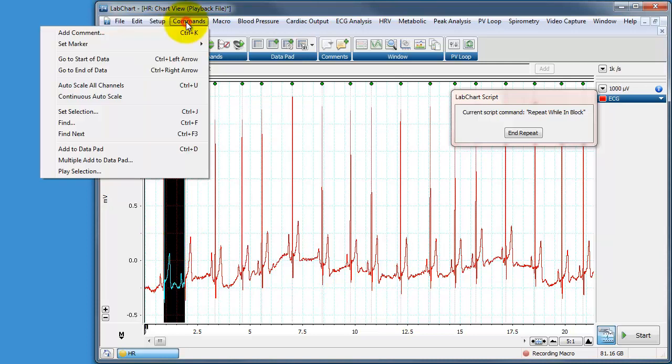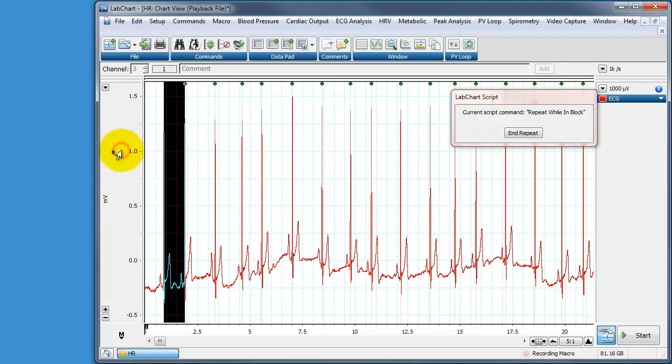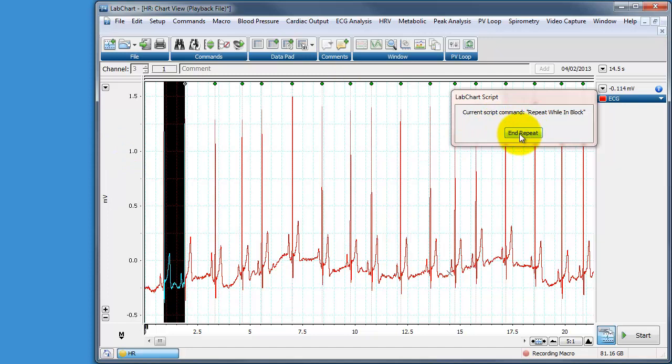So we're going to go to commands now, add that to data pad. And that is our cycle, that is our looped cycle. So now we can end the repeat by clicking on the end repeat button.